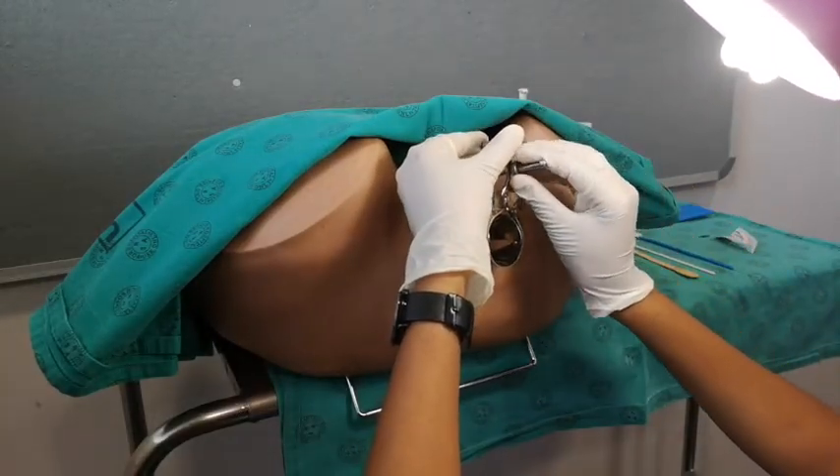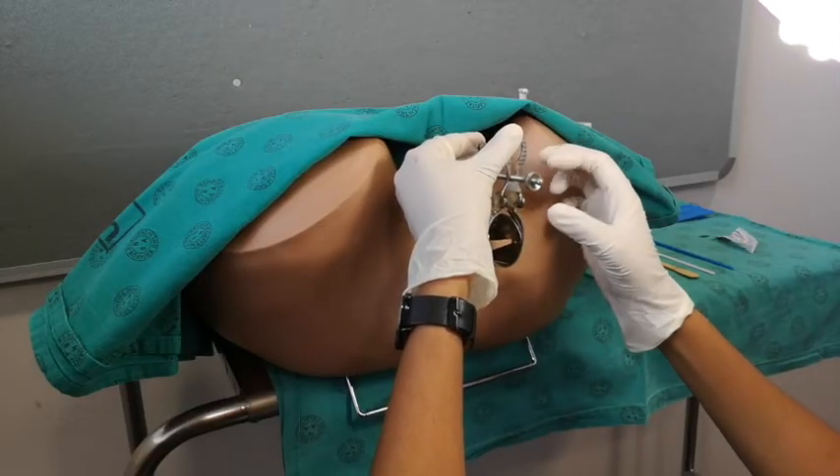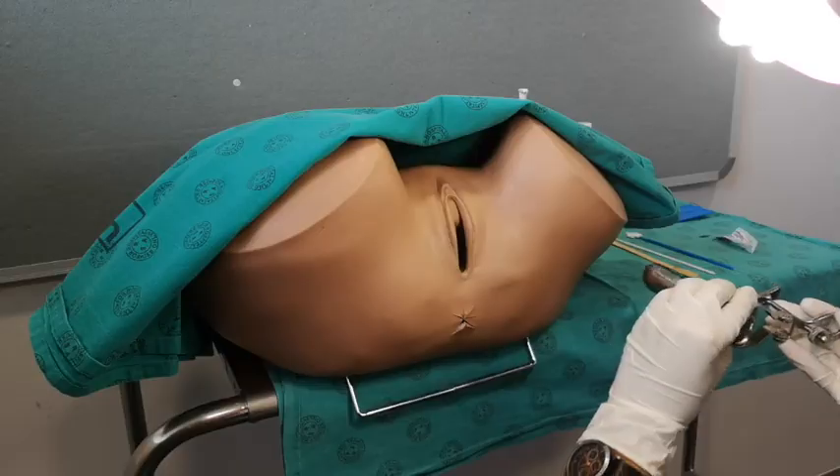Having collected your specimen, loosen the ratchet and withdraw the speculum slowly. Examine the vaginal walls as you withdraw the speculum.